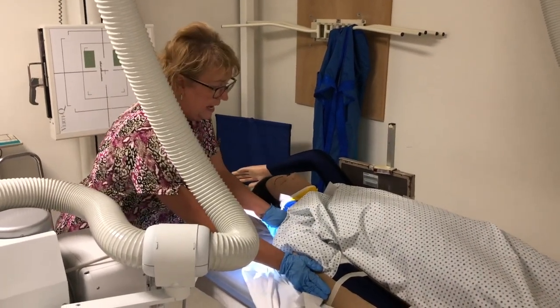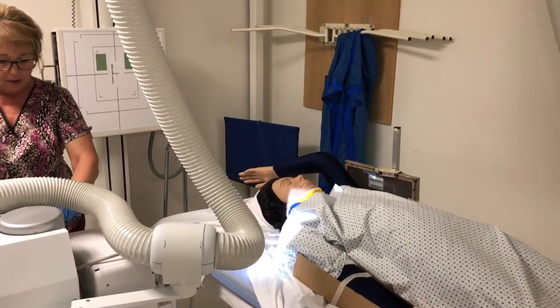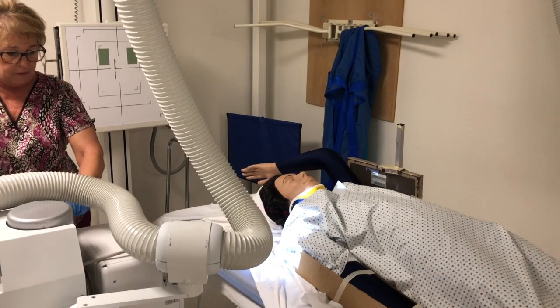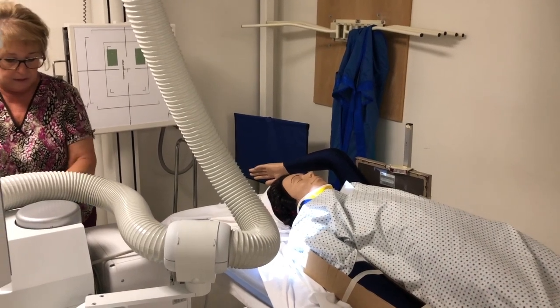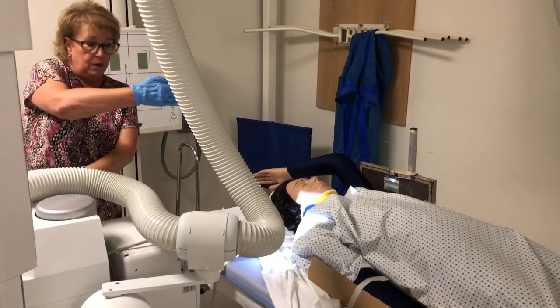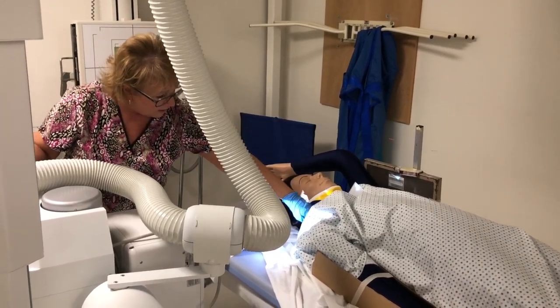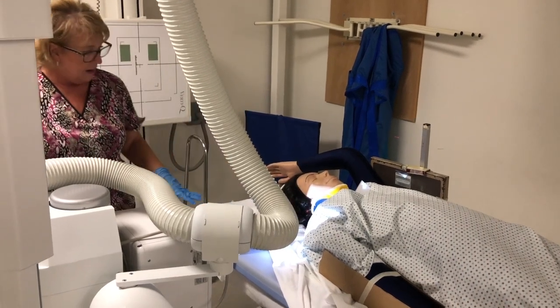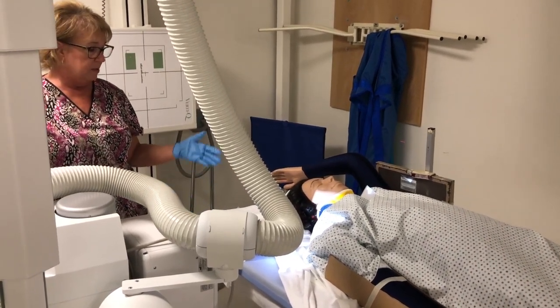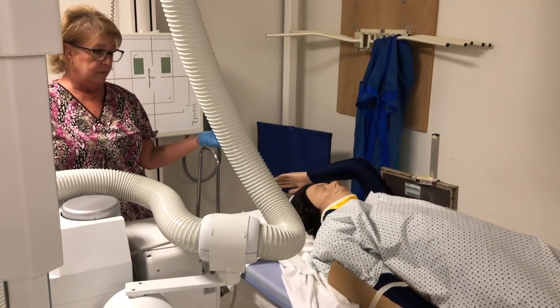Again, if I cannot depress this shoulder enough, what I could do is throw maybe a 5-degree caudal angle in the tube, so that now I'm coming up and over her shoulder, exiting at the center of the IR, and then expose when it looks like I've caught her between breaths.